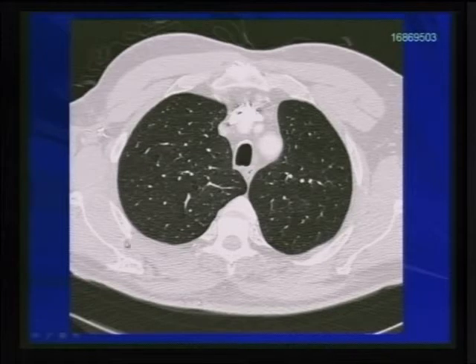Again, this is an example of a very subtle but early pulmonary emphysema with these areas of decreased opacity. Just very quickly, the pan-acinar emphysema is a little bit different in the sense that it's not just involving the center of the secondary pulmonary lobule, but diffusely involving the lungs. And then you have hyperexpansion. It's much harder to detect when there is diffuse involvement, but as you can see, there's a much decreased number of pulmonary vessels that are seen, and the supporting connective tissue is not that well seen.